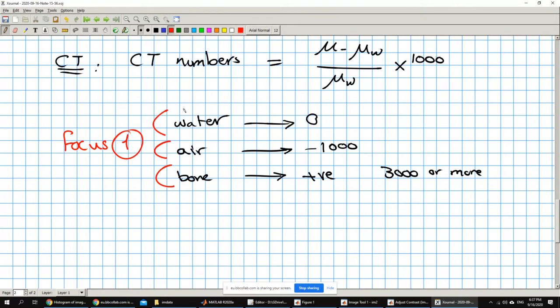Okay, so basically, this is like a soft tissue window, this is like an air window, this is like a bone window, and basically from the same image you can get 2 different or 3 different images that look very different, but actually they represent different components of tissues inside that image. So instead of, for example in MRI, where if you want to look at different things, you usually have to run different sequences to get different images. For CT, you can get one image, and using the way you display the CT image, you can get different images based on that.